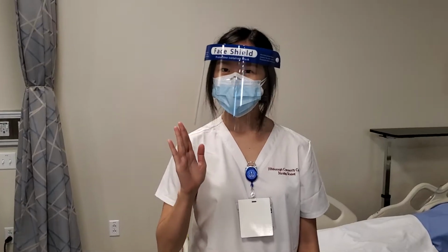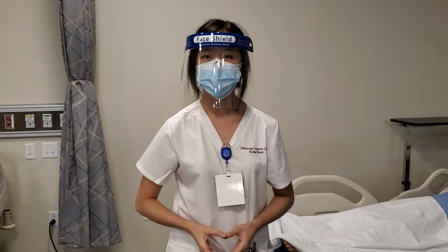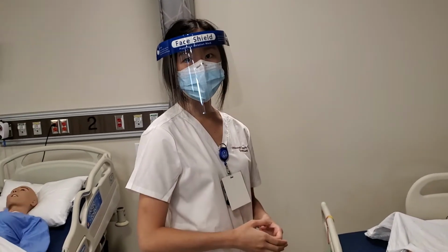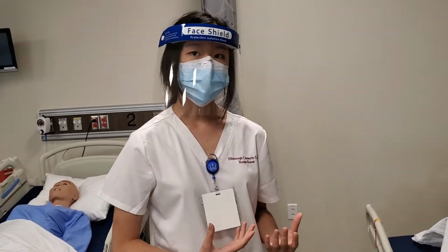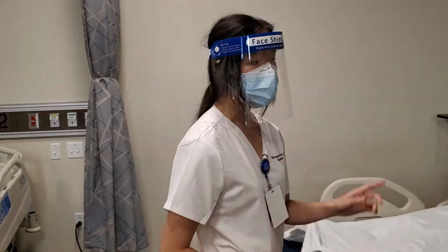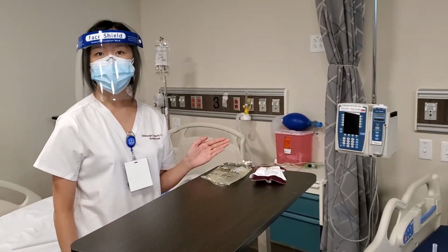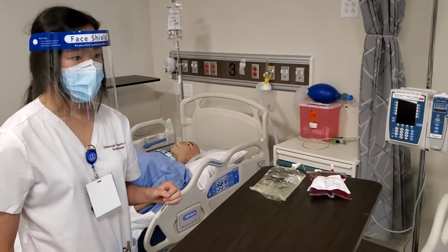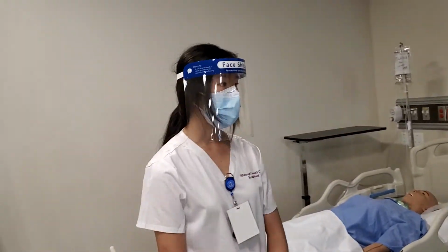Okay. Hello. So the doctor has ordered a blood transfusion to be administered to my patient. So I'm just going to recheck my orders and then check the facility policy. And then now I will gather my supplies, which includes equipment for measuring vital signs, the Y-shaped tubing, and the 250 milliliter bag of normal saline. And then now I will prepare for the transfusion.